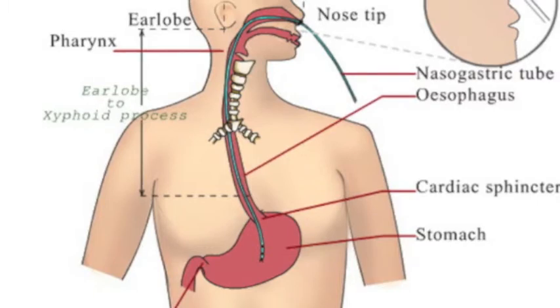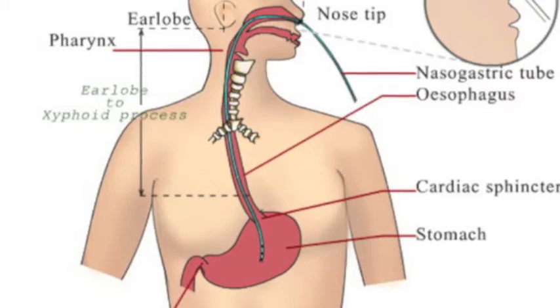So what would you like to do first? Clamp it. Thank you. Clamp it. Stop the suction. Empty your canister. Put them back up. If you don't, it'll just fly everywhere. Yes, that's nasty. And your patient won't like you very much because then they're going to be soaked with that stuff.